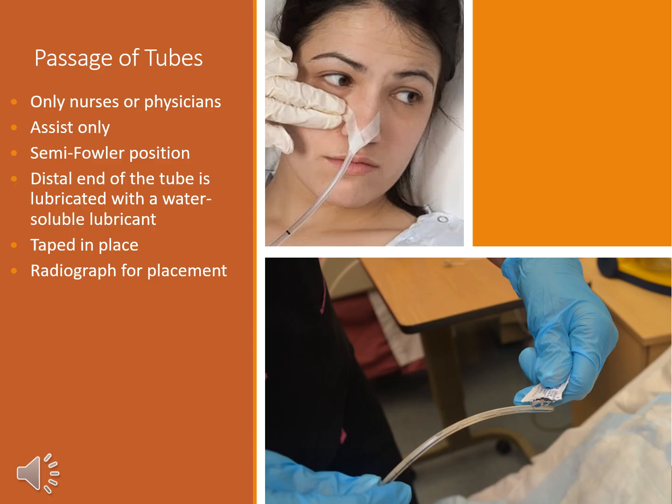Typically, a registered nurse will insert an NG or an NE tube, sometimes a physician as well. Since tube insertion can be uncomfortable and distressing for the patient, especially if they are very ill, it's important for the procedure to be explained to them beforehand. If the patient focuses on swallowing and breathing during the insertion, the process will be a lot smoother and quicker.